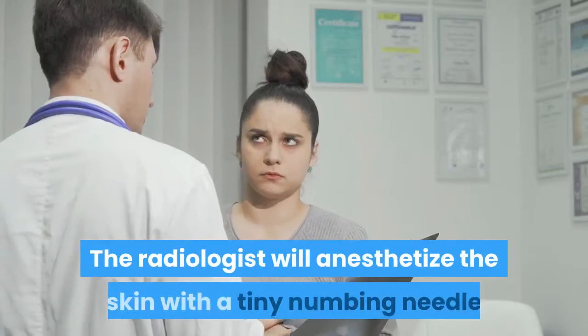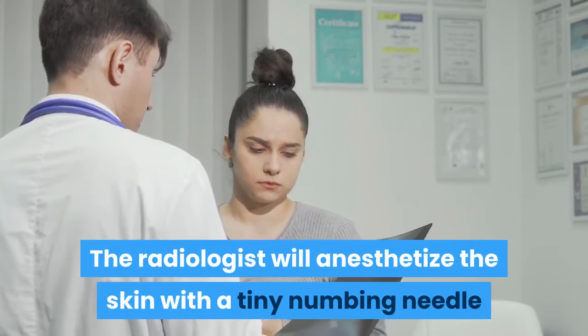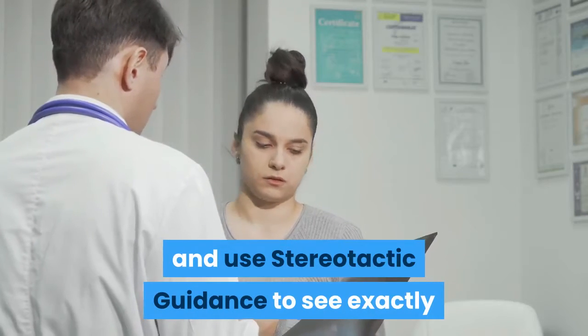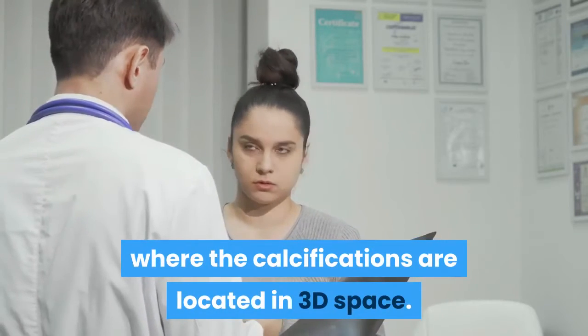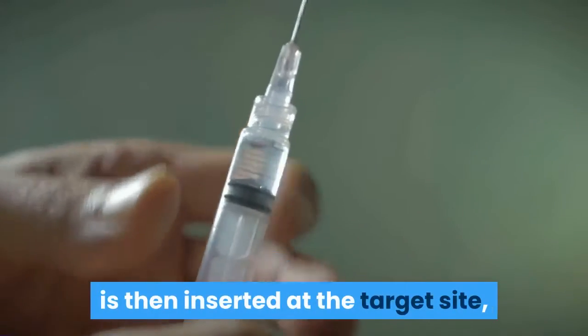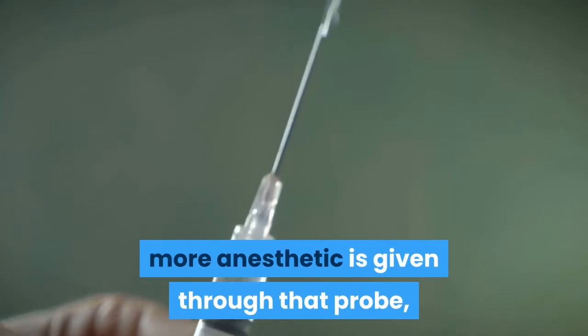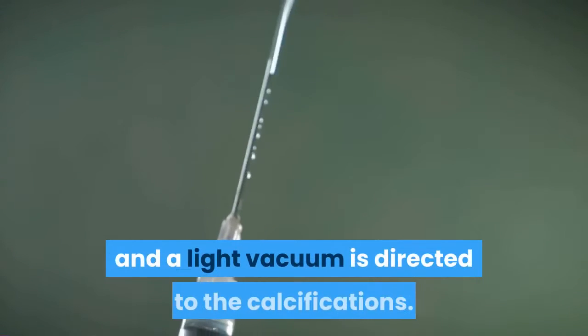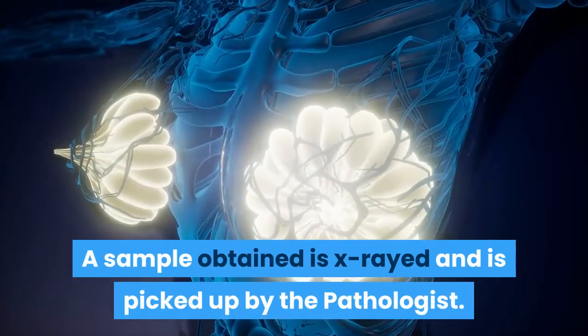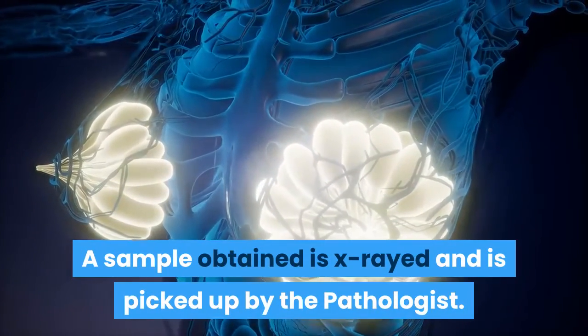The radiologist will anesthetize the skin with a tiny numbing needle and use stereotactic guidance to see exactly where the calcifications are located in 3D space. Another special needle called a probe is then inserted at the target site. More anesthetic is given through that probe, and a light vacuum is directed to the calcifications. A sample obtained is X-rayed and is picked up by the pathologist.